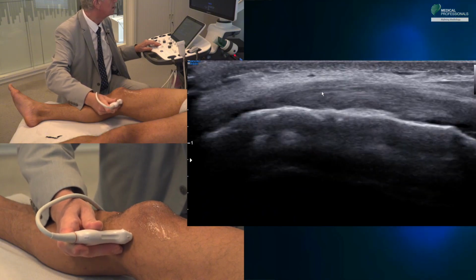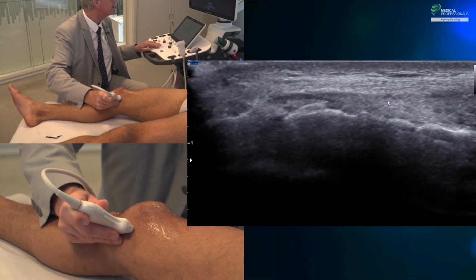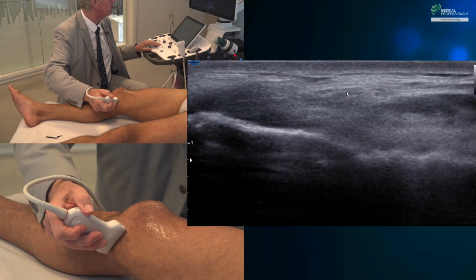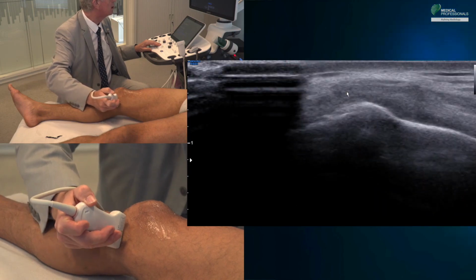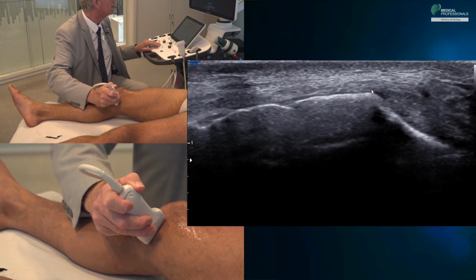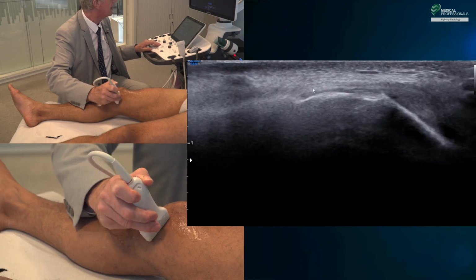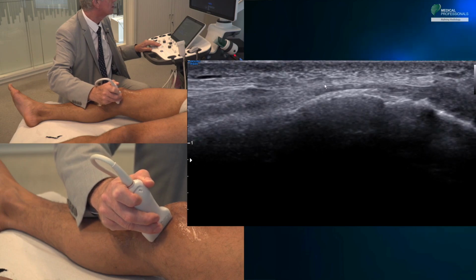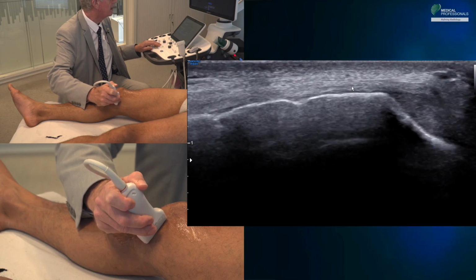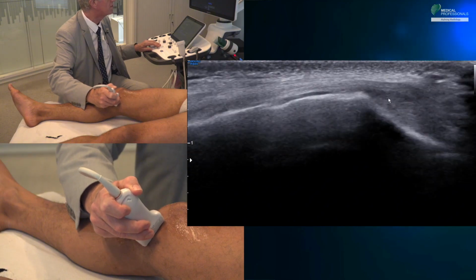And we see that one has to go high, very high on the femoral insertion of this ligament to completely study it. We scan the entire insertion zone in two planes, the coronal and the axial planes. In this axial plane, it is important to check the connection between the medial collateral ligament and the medial patellar retinaculum. This retinaculum is continuous with the ligamentous structure, and when there is a sprain, there may be a disinsertion of the femoral attachment of this medial patellar retinaculum.